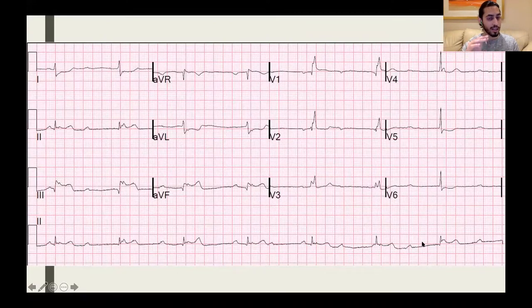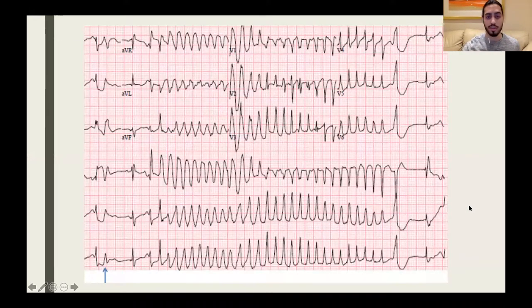Bundle branches, if you think about it, is when you have a blockage of one pathway of those bundle branches. They can present themselves with complete heart block as well, because in complete heart block, you've got no association between the atria and ventricles. On top of that, if you've got a complete occlusion of one of the arteries that's supplying one of the bundle branches, you can get that as well. So loads of signs in this ECG, and you've already kind of got a whole clinical picture just from this 12 lead ECG from the viewpoint of the heart. It's really amazing. Last two ECGs, guys.